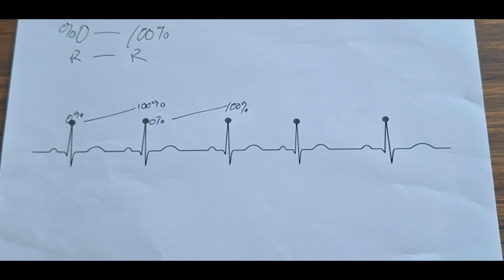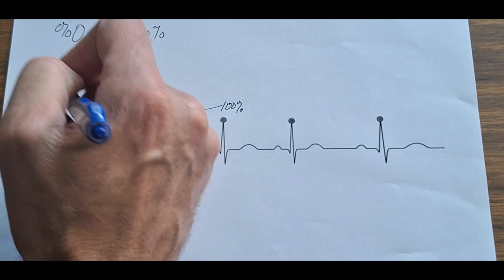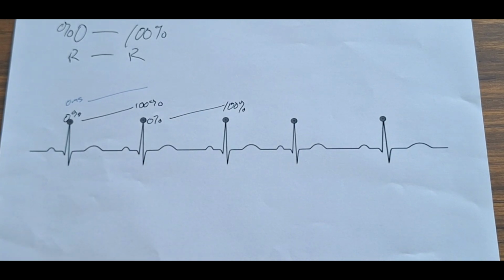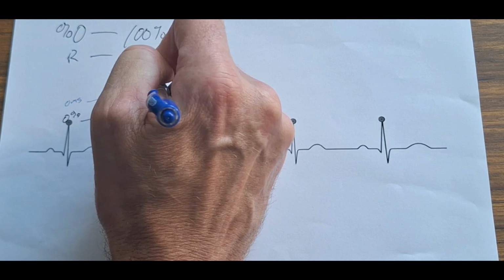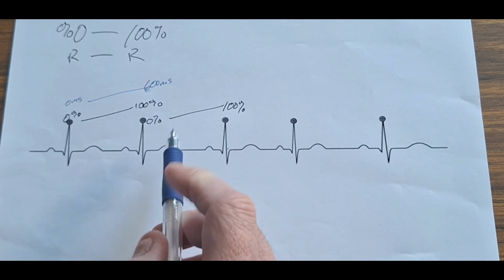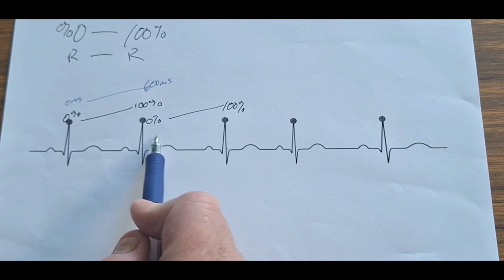However, in millisecond scanning, it is different. In millisecond terms, remember it starts at 0 milliseconds and then goes up to a number determined by the heartbeat. Let's for today just say that this is going to go up to 600 milliseconds for this beat. Now we can see this beat's a longer beat in time.